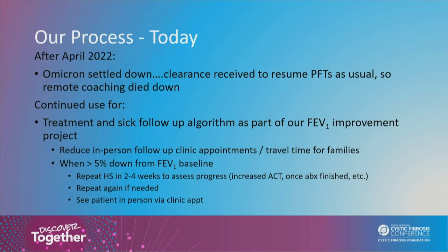Oral antibiotics may or may not be prescribed at that time. And then we say, based on what the plan is, after you're done, 2 to 4 weeks later, or after your antibiotics are finished, repeat your home spirometer. We'll schedule an appointment with the lab, and then we make a note and look for it in the ZephyrX dashboard. At that point, if the FEV1 is not improved, then we may make some adjustments, and then we ask them to repeat it again. And then if it's still not improved, another 2 to 4 weeks later, then we'll bring the patient back in for an in-clinic appointment.